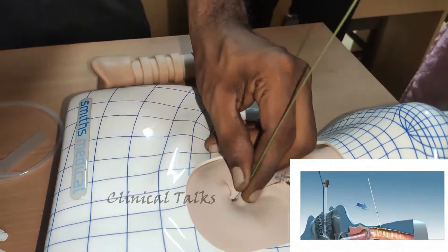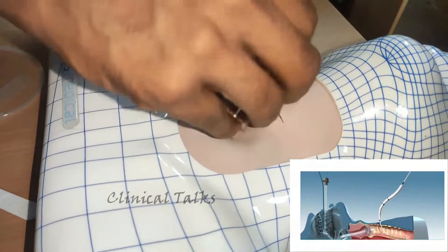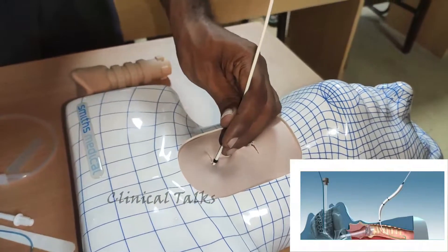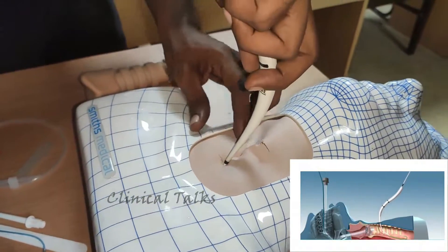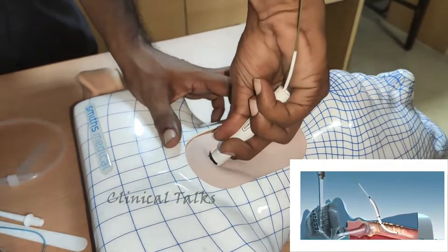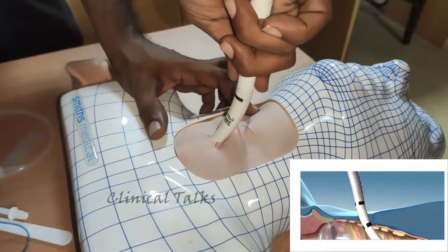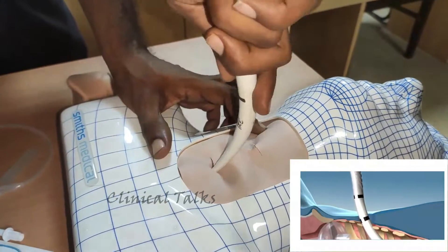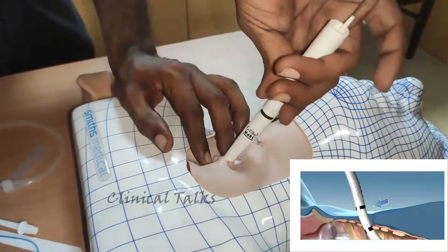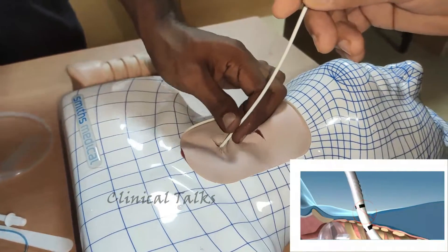Step 5. Pass the long guiding catheter over the guide wire into the trachea, in the direction of the arrow mark, until the black safety stop on the guiding catheter is located at skin level. Step 6. Pass the dilator over the guiding catheter until it reaches the black stop. The proximal mark of the guiding catheter is just visible at the handle end of the tapered dilator. While stabilizing the guide wire and catheter assembly, insert and partially remove the tapered dilator several times in order to over-dilate the trachea to a size appropriate for the tracheostomy tube.